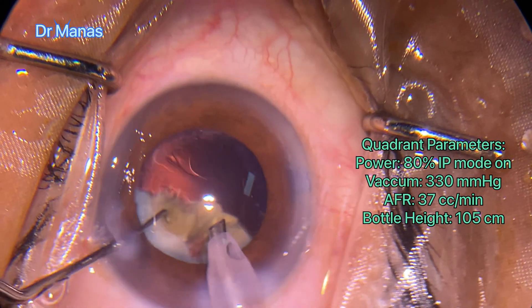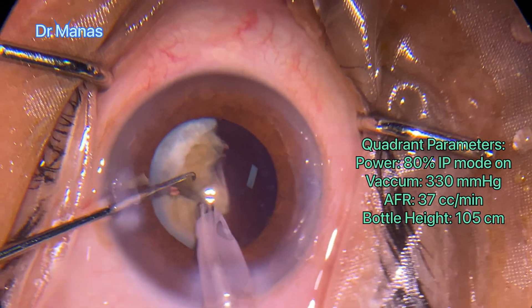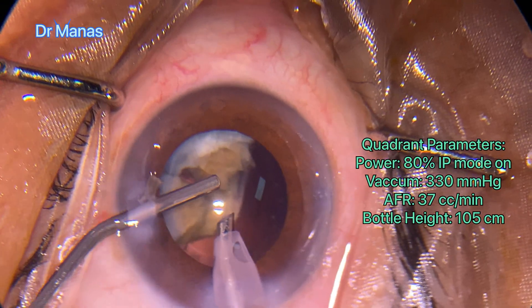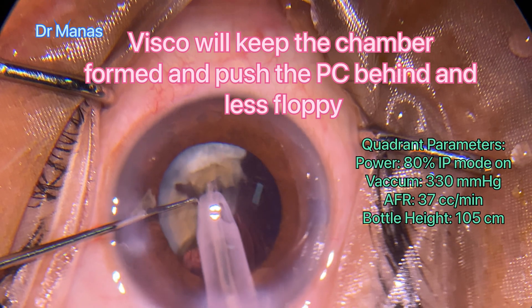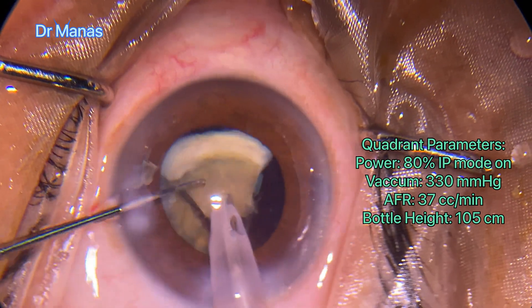Now only two pieces are left. I want to come out and put viscoelastics because with only two pieces remaining, the posterior capsule can be quite fragile. I injected viscoelastic and then continued with the quadrant emulsification.